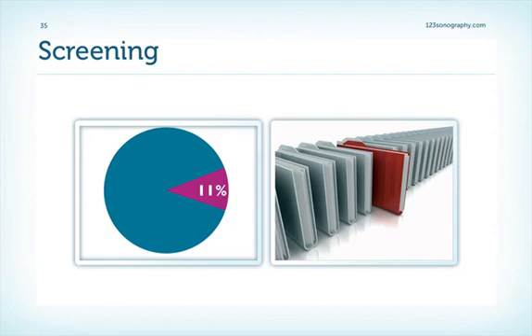The ideal screening tool is echo, and in a survey performed in an echo lab, out of 4,579 patients, 11% could be identified suffering from pulmonary hypertension, taking an ASPAP of over 40 millimeters of mercury as a cutoff value.